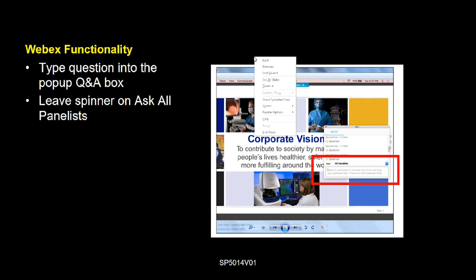Thanks, Dr. Cohen. Our last question is, what do you do when you cannot retrieve a polyp? Actually, the best answer to that is, what did you do before you couldn't retrieve that polyp? In other words, I assessed the polyp really carefully, and one reason to do so is to make sure that if you cannot retrieve it, you at least know a little bit about what you were dealing with. And when I say I assess them, I don't just assess them. I also take a really good picture. I think people underemphasize taking a good photograph of what they see so they can go back and look at it again afterwards. I think that's important.